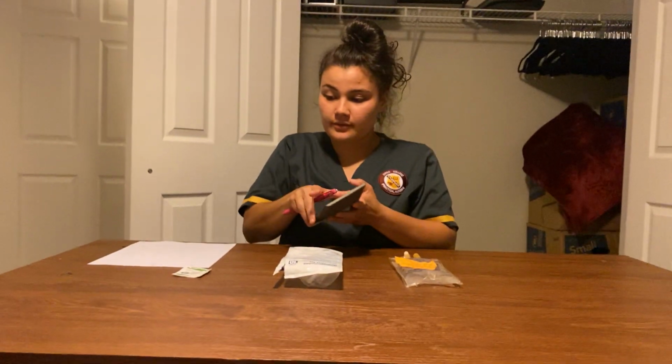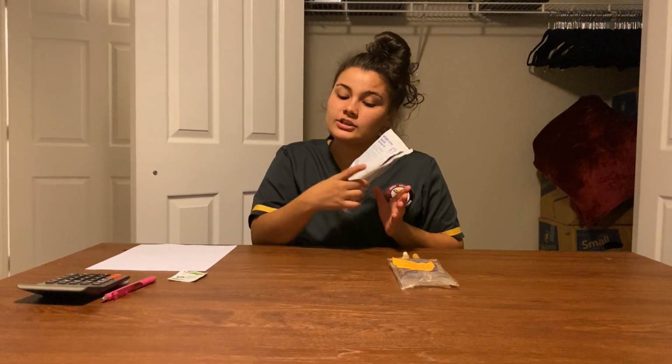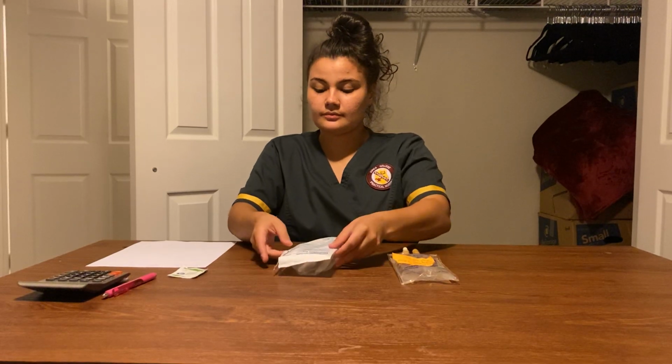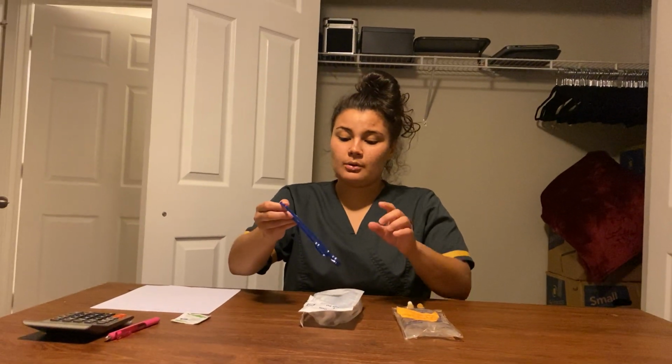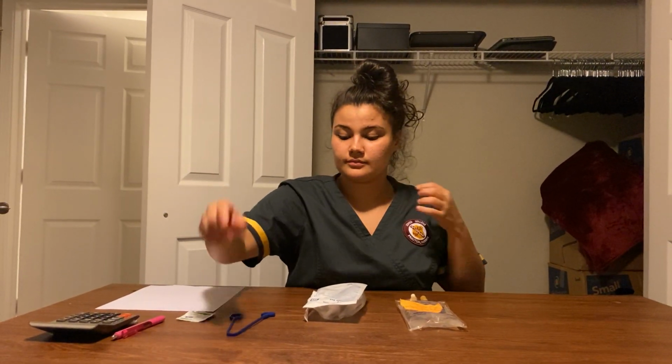Okay, so now I'm going to open up my secondary medication tubing. Now, whenever you open this up, you need to try to maintain sterility with these ports. So here is my hanger for my tubing and my medication.